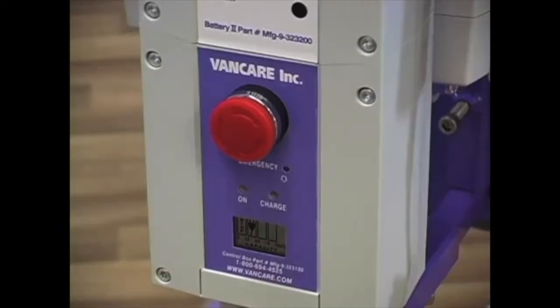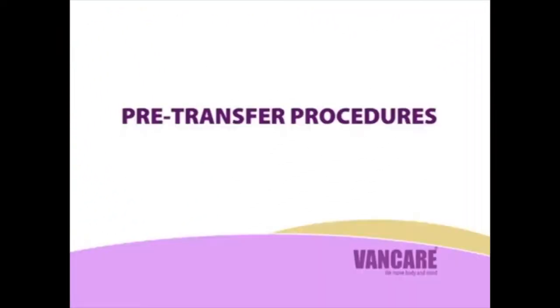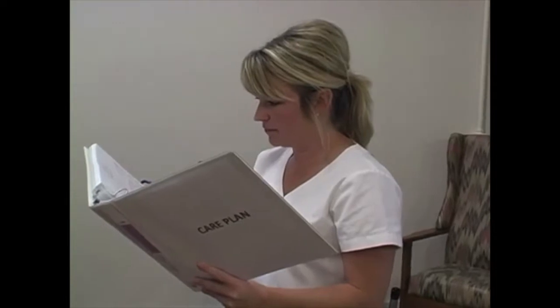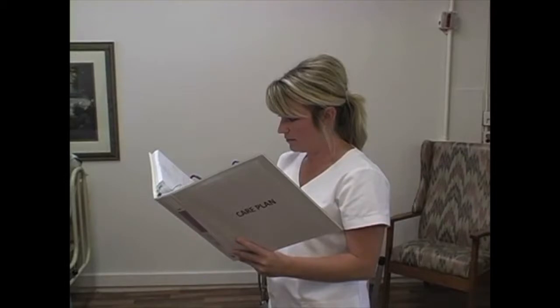When the problem has been corrected, turn the emergency stop knob clockwise to the right and the lift will operate. Pre-transfer procedures. Care plan: Before transferring the client, check the care plan to find out how many staff members are required, which size back belt or sitting sling, and which method of connecting the sling to the lift arm hooks is to be used.